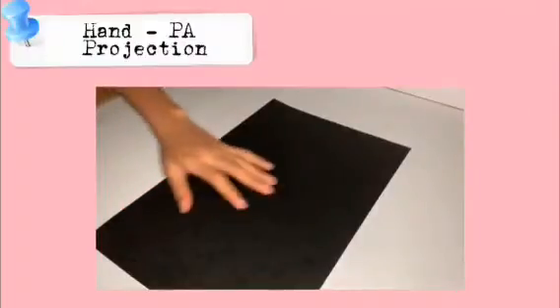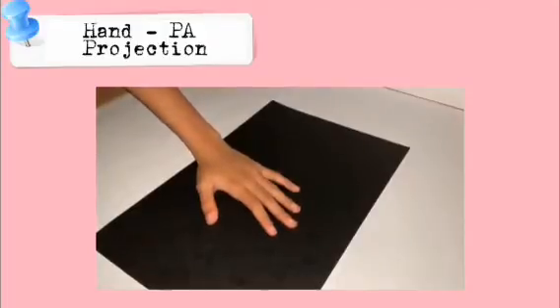Video, I'll be doing the hand PA projection, hand PA oblique projection, hand lateral projection, and hand fan lateral projection. Hand PA projection. Position of part.